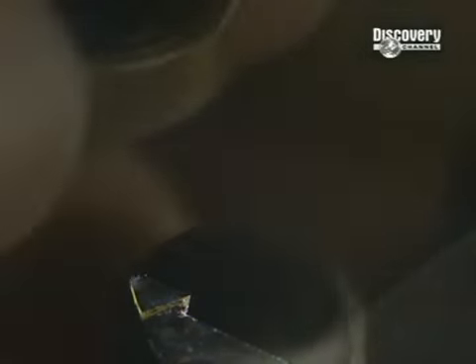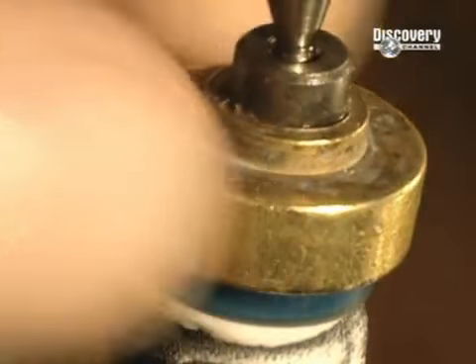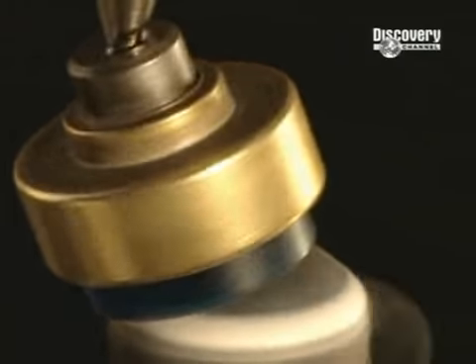The disc must be free from any imperfection and is polished with a super-fine abrasive paste. Polishing is an essential step because it guarantees excellent comfort and perfect vision.